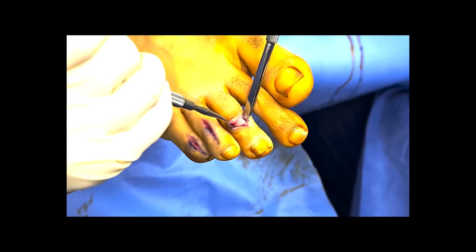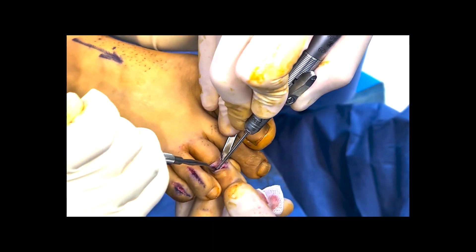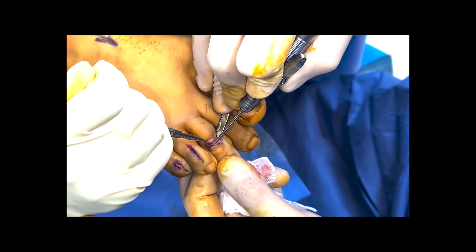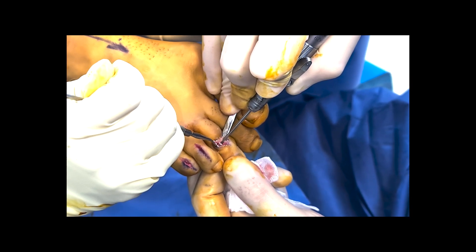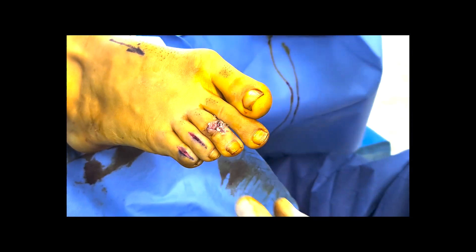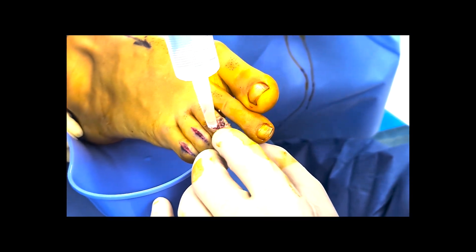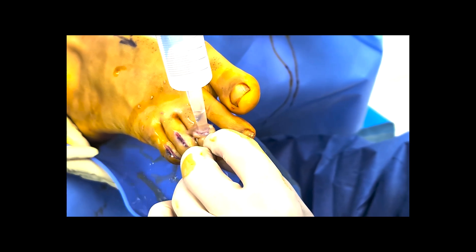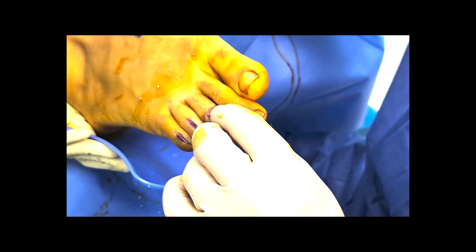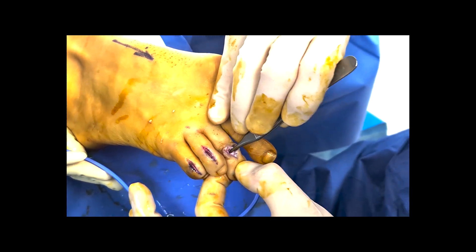It is very important to protect the small nerves and blood vessels that innervate the toe. This will minimise the amount of swelling post-operatively. Here the bone cut was performed by a straight Shannon Burr. You can see the bone cut there and it will be put in this much.